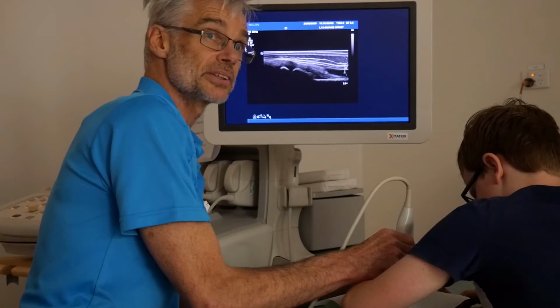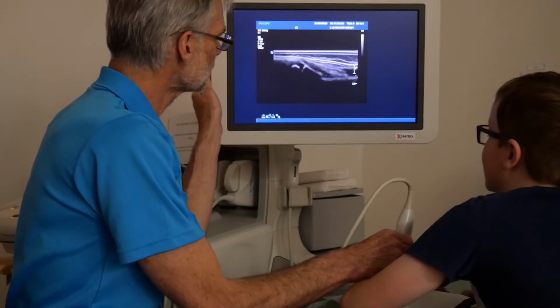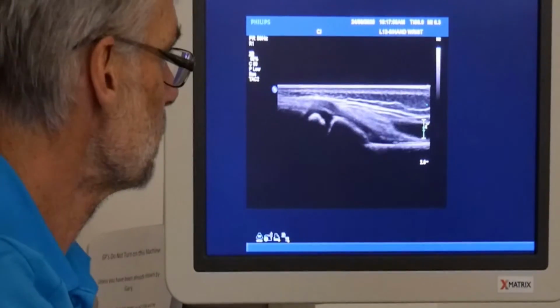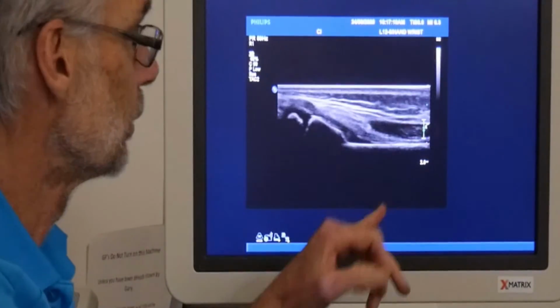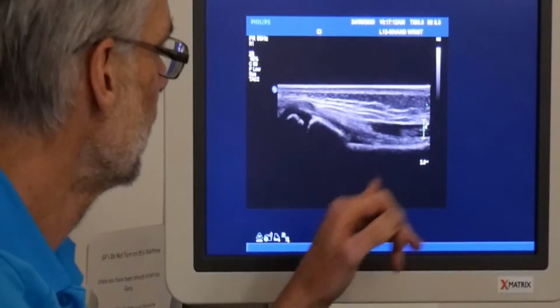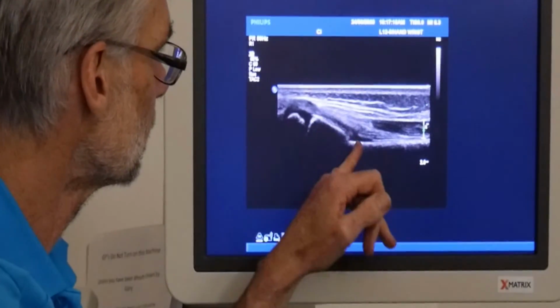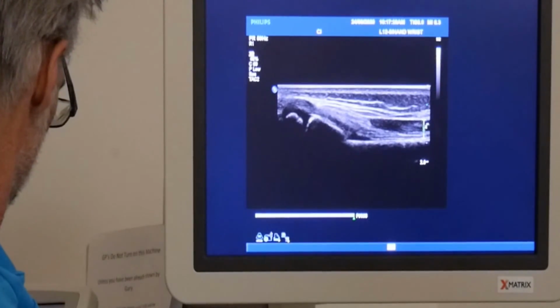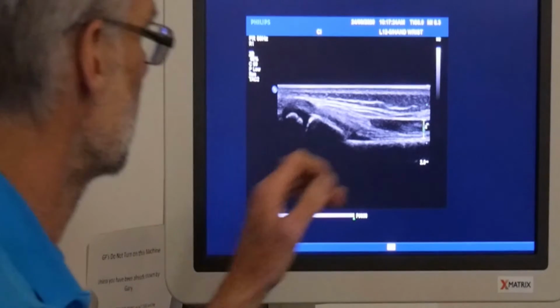You guys might want to see this if you like. We'll get Mum to have a look as well because she'll want to know what this looks like. So we put it on the skin in the longitudinal plane right on the dorsum, and you can see the distal radius straight away, and you can see the fracture there as well. You get a sense very quickly how easy it is to see the fracture.